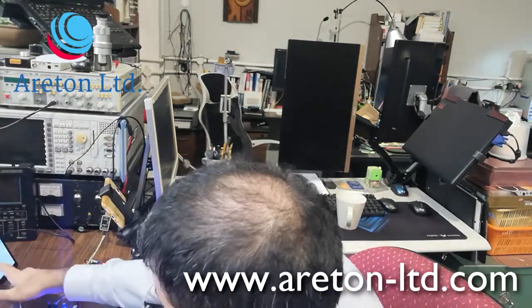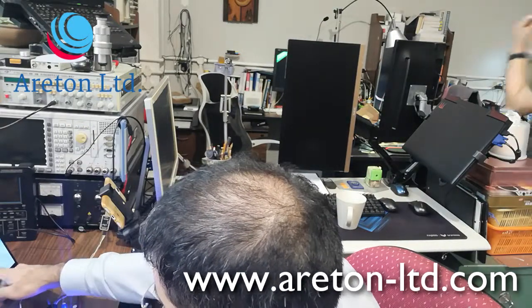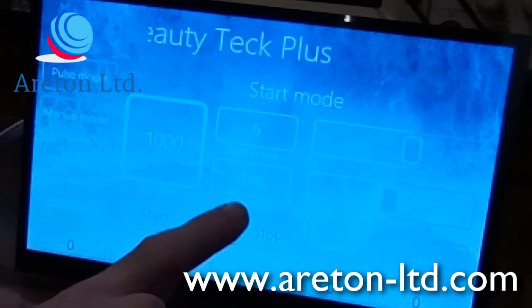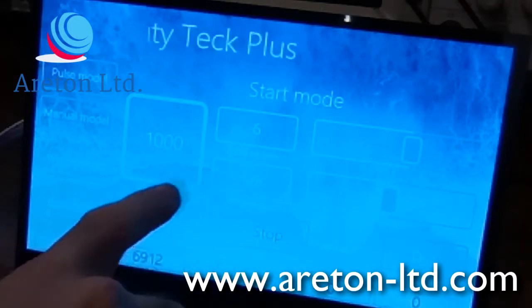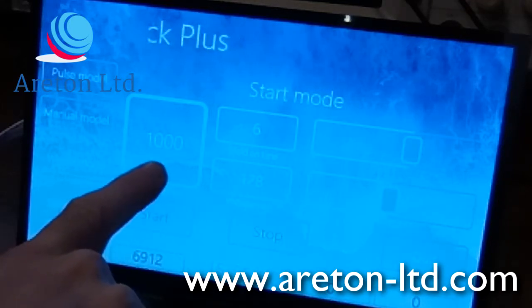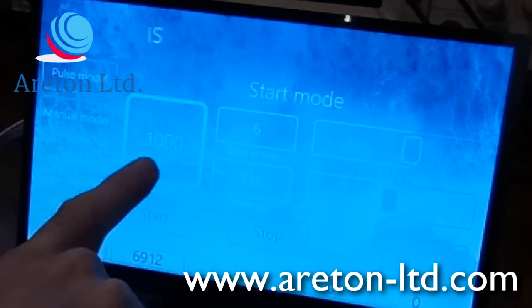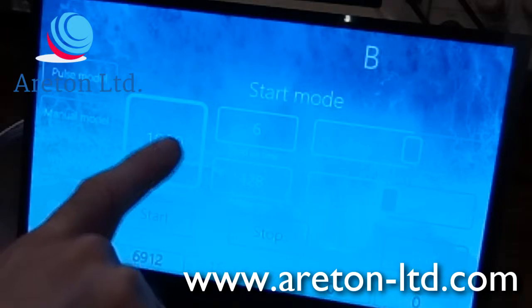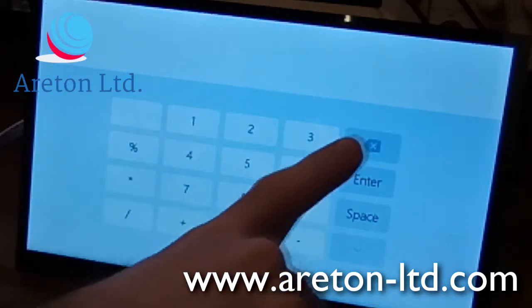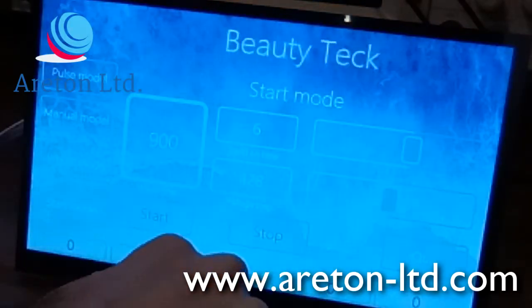So what I'm going to do, I'm just going to go into the start mode first. I've got to set it up so that the start time is 1000 milliseconds. So basically it's going to keep the arc on for 1000 milliseconds. Because we actually talked about 900 milliseconds in the video, we're going to do 900 just to make it an exact match.